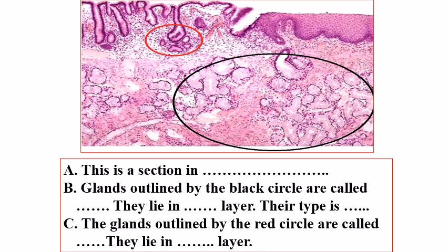Here, dear students, is a long strip. Here I'm having a section and here I'm having another section. Look first at the epithelium. It is non-keratinized stratified squamous epithelium, and these are mucous glands. So it is as if I'm seeing the esophagus, so it is the gastroesophageal junction.